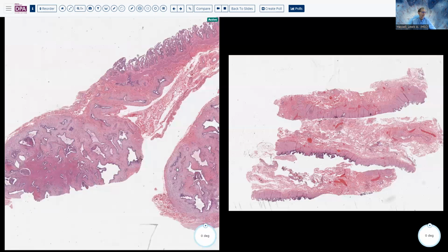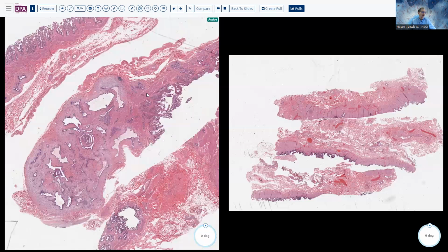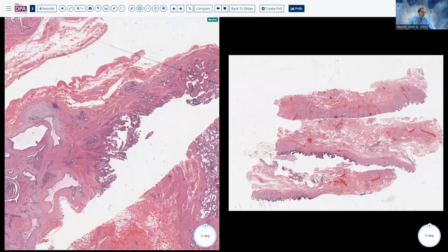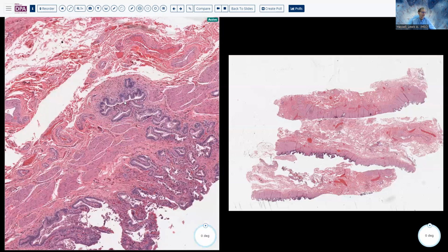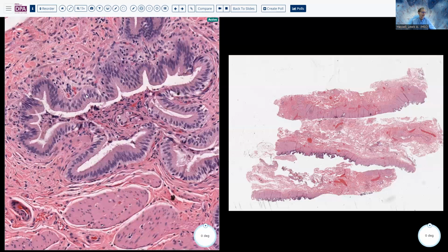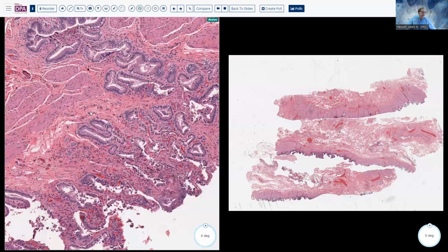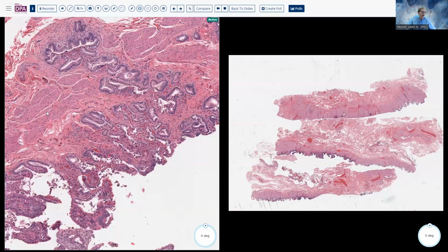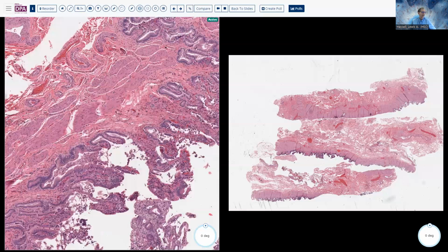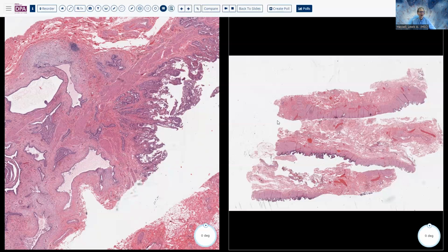Most frequently, this adenomyoma is a lesion in the fundus. And clinically, radiologically, it can be mistaken for a gallbladder carcinoma. You do want to make sure that here you got a Rokitansky-Aschoff sinus out here at the adventitia. Notice again that the cytology here is identical to that you see up here. So when you have dysplasia up here, you very easily can have dysplasia down here, as well as in these areas of adenomyosis, which can masquerade as invasive carcinoma.